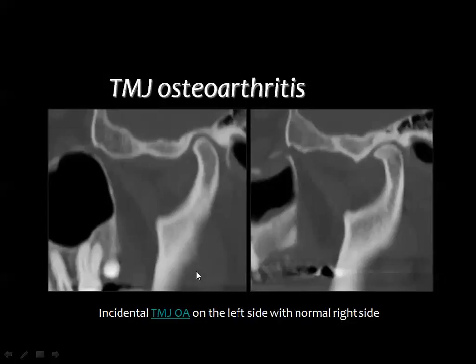And you may also have, in the previous days, we used to have the conventional X-rays and the conventional tomography for the temporomandibular joint, but now we may have the help of the mandibular panorama, or also you can use the cone beam CT, or also use the original multi-detector CT with reconstructed images for the region of the temporomandibular joint.